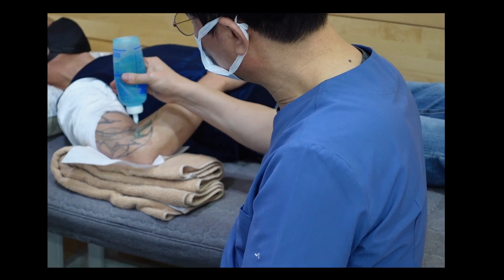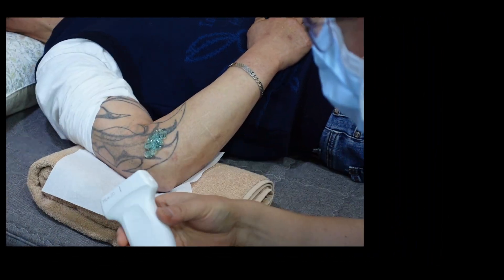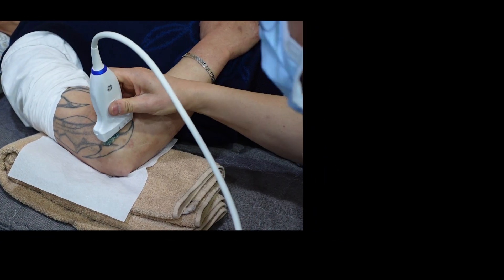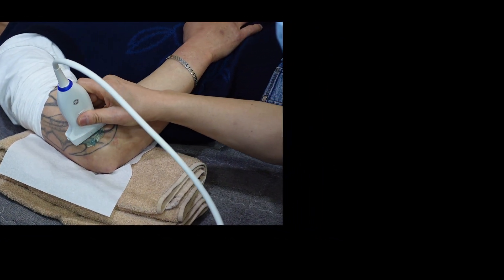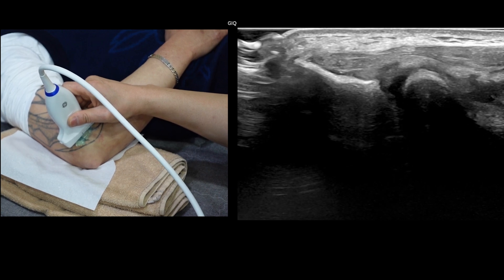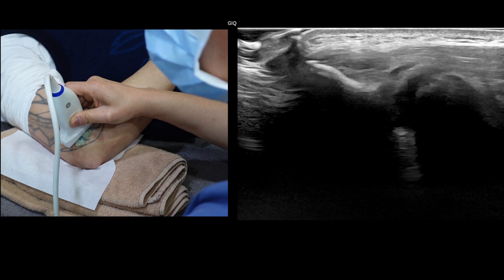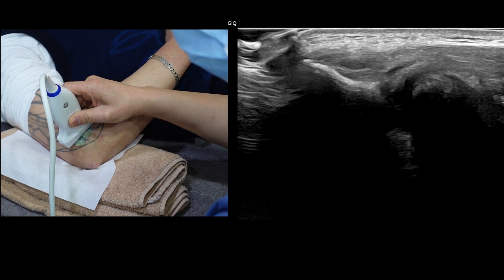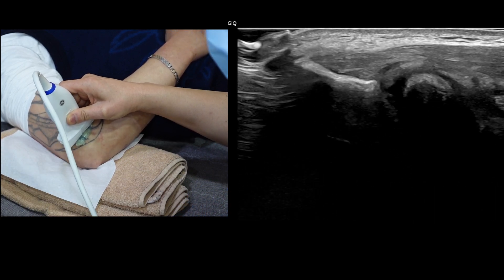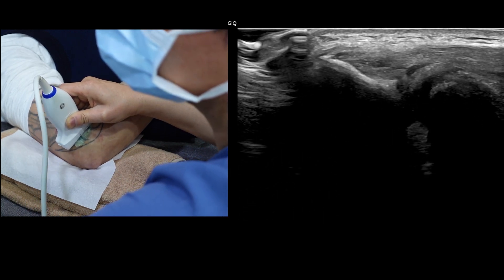Next, we will proceed with the ultrasound examination. I invite you to closely follow both the ultrasound probe and the patient's images. I'll show the entire ultrasound examination process without editing the video for a comprehensive understanding. We will start with a longitudinal scan of the extensor tendon, positioning the elbow in 90 degrees of flexion and pronation.